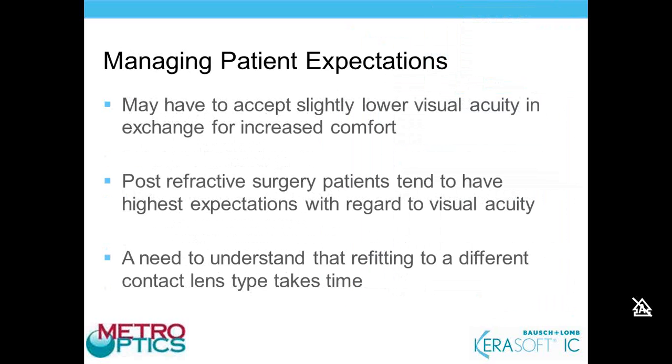So they have to decide themselves what they want, if they want improved comfort or if they want improved vision. And in some cases, I've had better vision with the KeraSoft than the GP, and the converse is true. So really, that's why it's helpful to have a diagnostic fitting set in your office, because you'll know the endpoint and the patient can preview it in the chair.